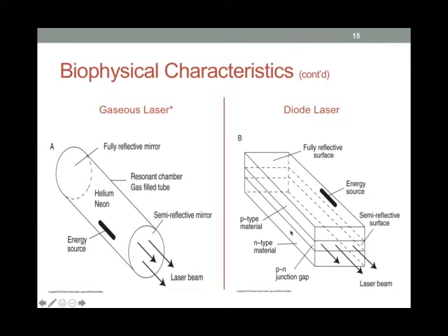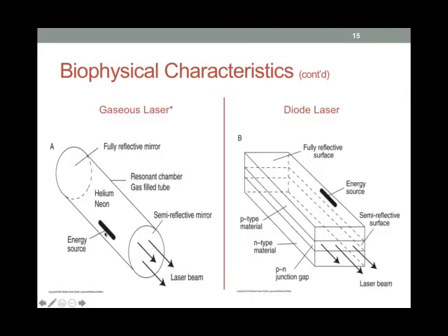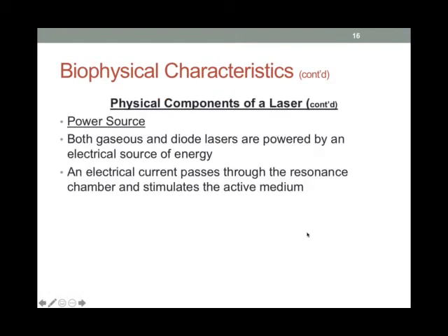If you want to see that in a little more detail, you can go to YouTube. There are lots of videos to show you more about how diode lasers work. Again, you do not need to know that for the course. Okay, and in both of them you see that there's an energy source or a power source. So that's the third component of a laser that's important.